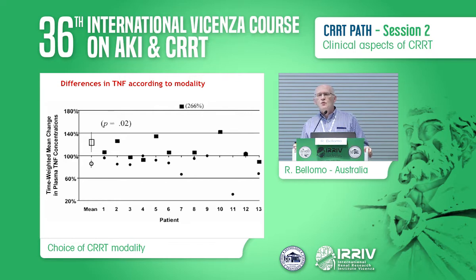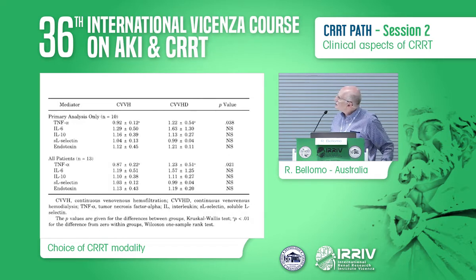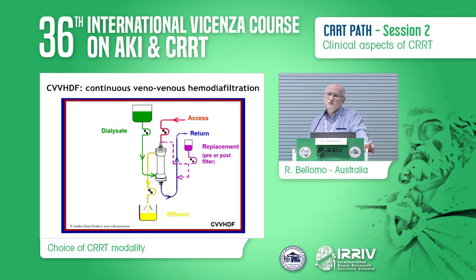was an increase in the time-weighted concentration of TNF in this particular case with CVVHD, but this did not happen with CVVH. Now, whether it's membrane adsorption or a little bit of clearance or a combination of both, there was a statistically significant difference in the effect of these two modalities on TNF. Of course, this is a potential biological difference, and the clinical meaning of that is unknown. That's interesting, but even the physiological effect of that, let alone the clinical effect, remains unclear.